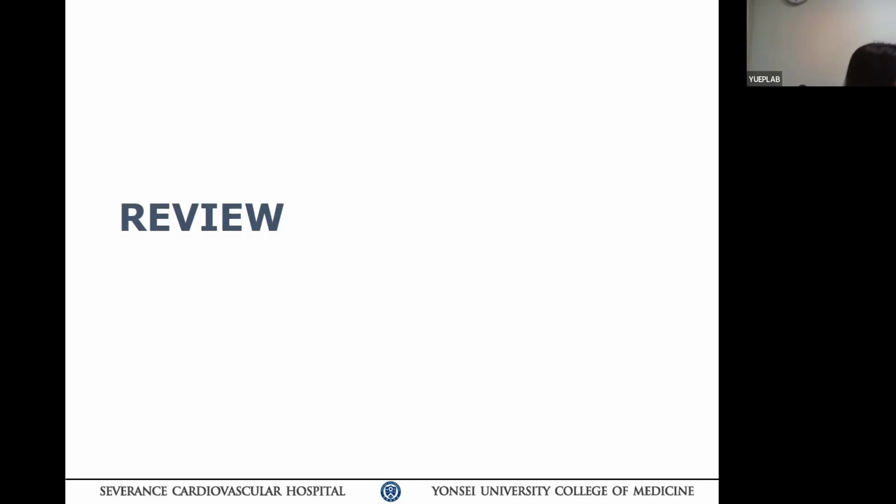Okay. Now a question: do you do subcutaneous or CSP ICD on this guy? Not available. I think it would be a good idea. Think about it, at least. Because the QRS is too wide, so those pacing modes would not benefit. Might as well give the benefit of CSP as well. Okay.